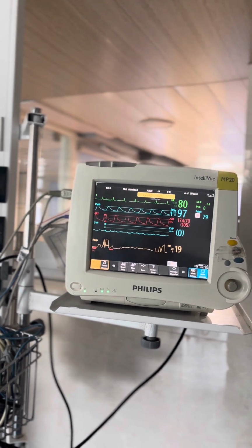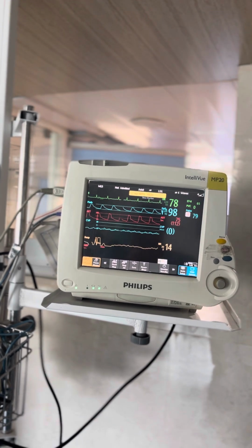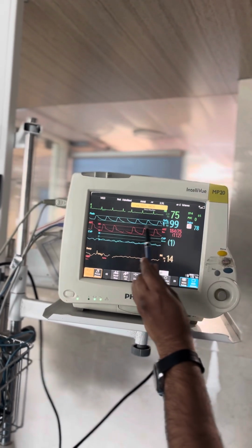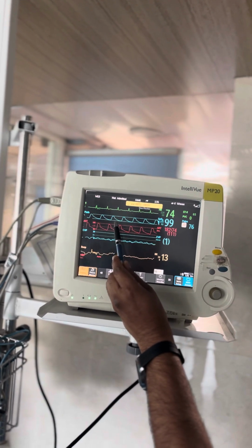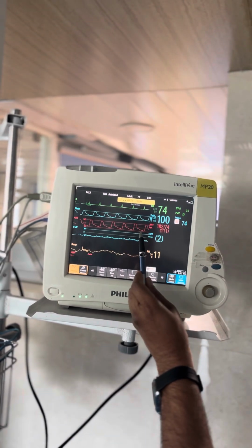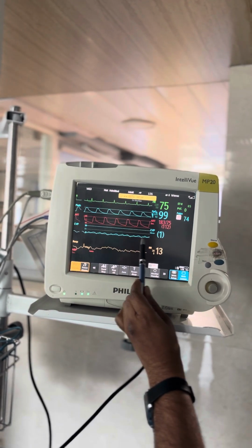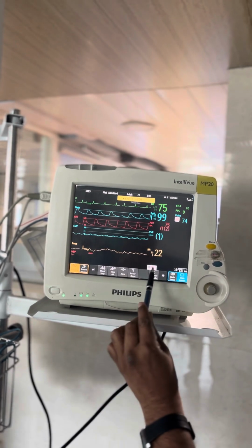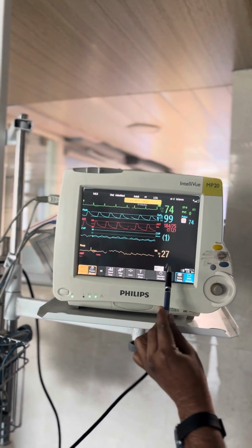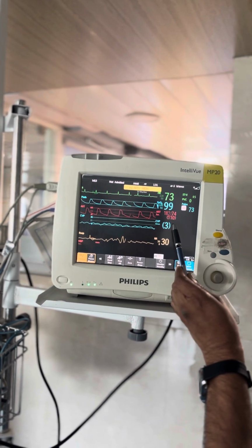Apart from the regular things, what we see in the CT ICU monitors are for any patient following any open cardiac surgery. This is the heart rate, which you commonly see. And this is the saturation, which is commonly seen, pulse oxy, in the ward also. This one is called invasive arterial blood pressure monitoring. This is called invasive central venous pressure monitoring. And continuously we'll be recording the patient's respiratory rate also. So how many are there? 1, 2, 3, 4, 5.